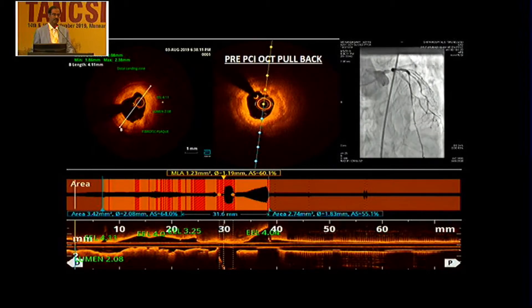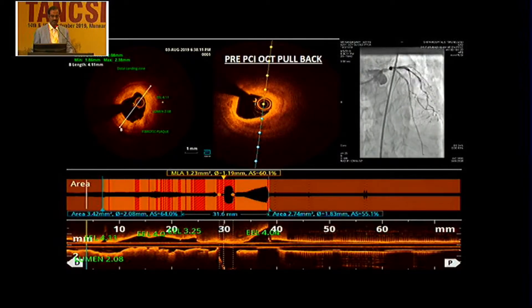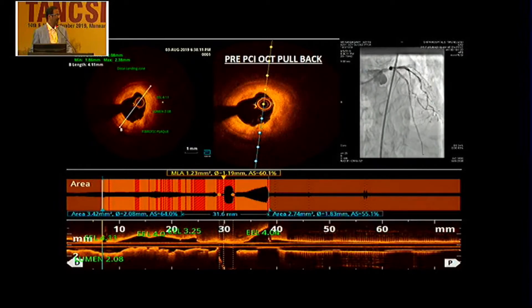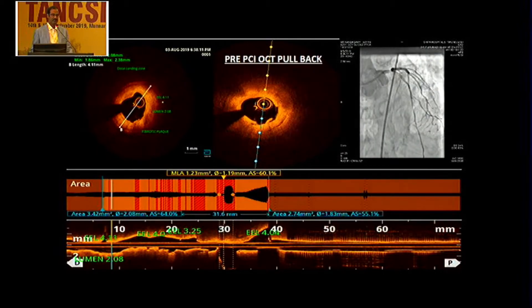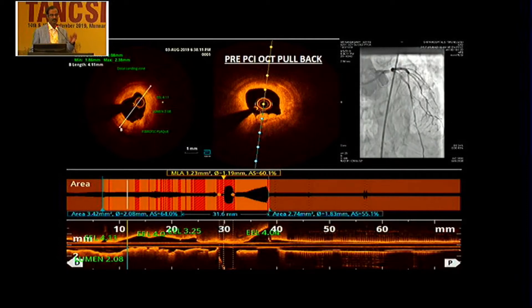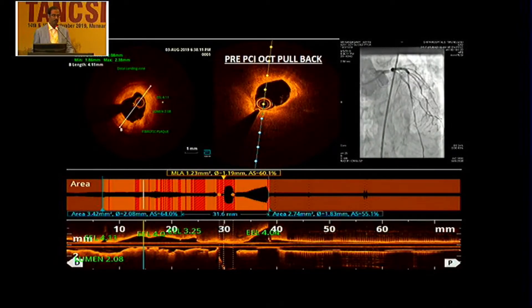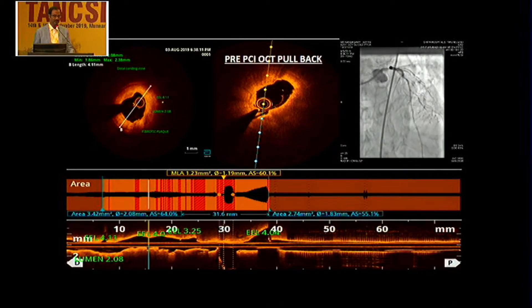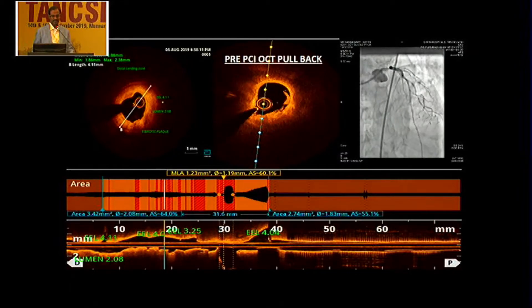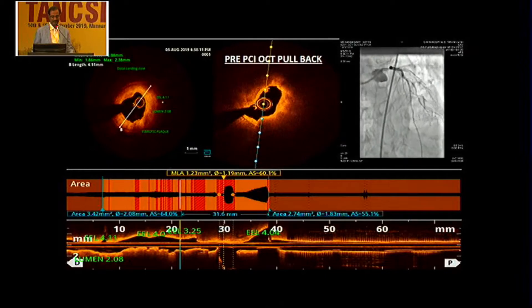This is the pre-PCI pullback. It shows that the ostio left main has a fibro-fatty plaque, with the distal left main showing more of a lipid-rich plaque, and the mid LAD with calcium in the proximal LAD and left main.